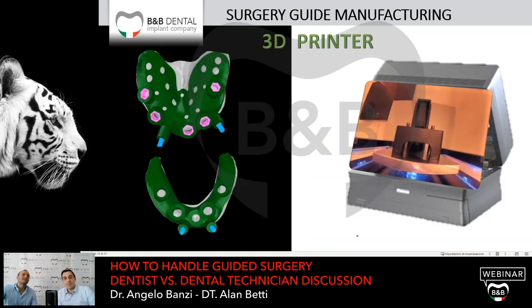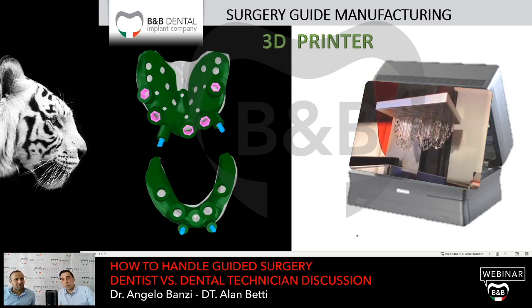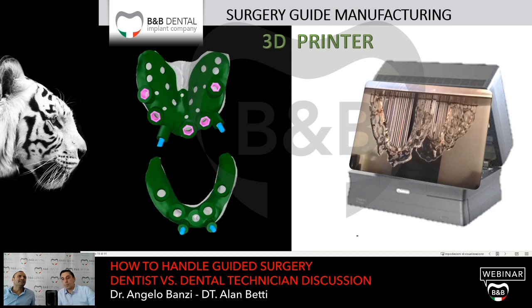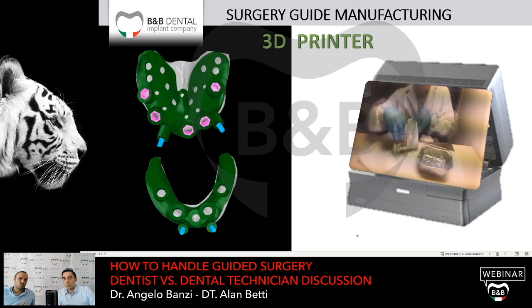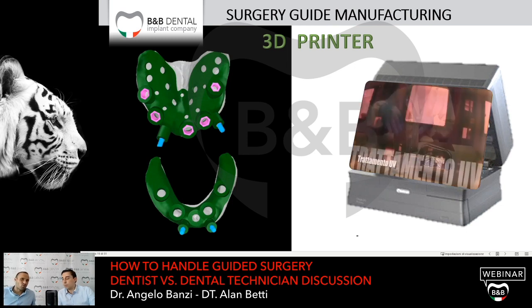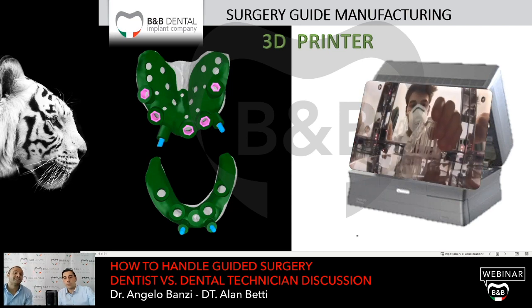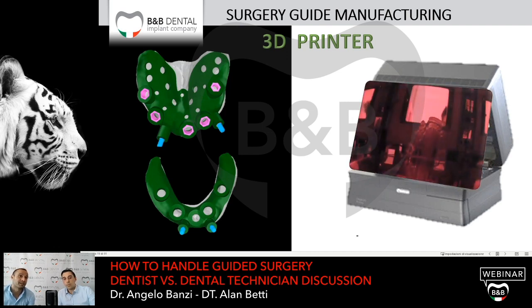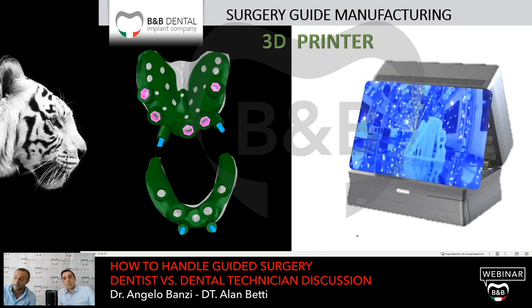Once the virtual surgical template is done, we put it in a 3D printer. Then we can move to the next steps, that is to print, to change from the virtual world to the real world, to take it from the virtual world to the real world. And this is thanks to the 3D printer. Some few words about the 3D printer. Do you have some advice?